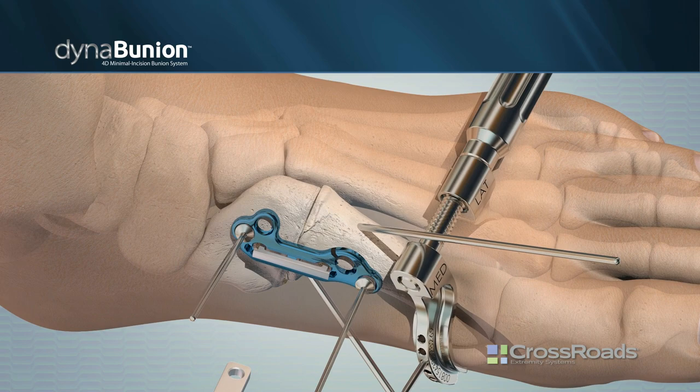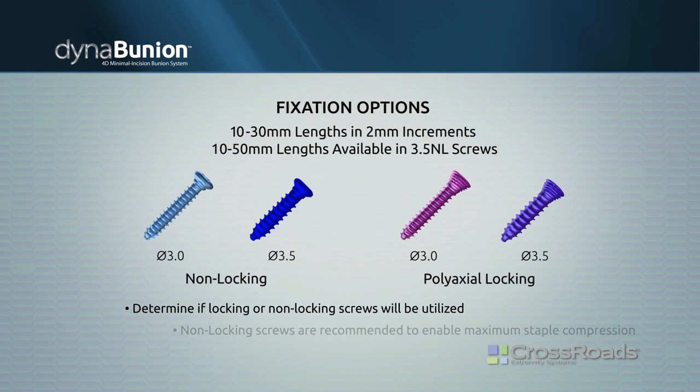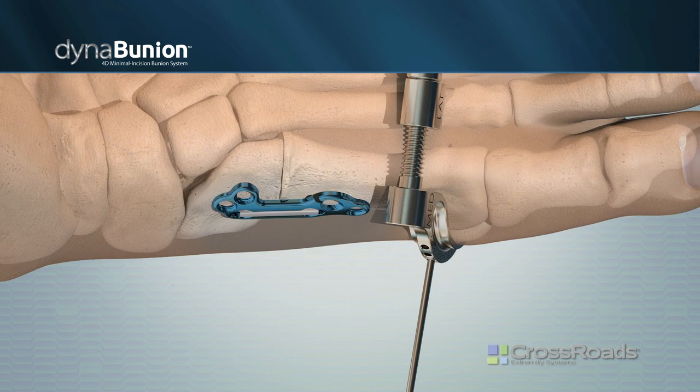Once the staple is placed, the olive wires and cross joint wires can be removed. Determine if locking or non-locking screws will be utilized. Place the drill guide onto the most distal hole first. Use a reamer to prepare a hole for the screw.